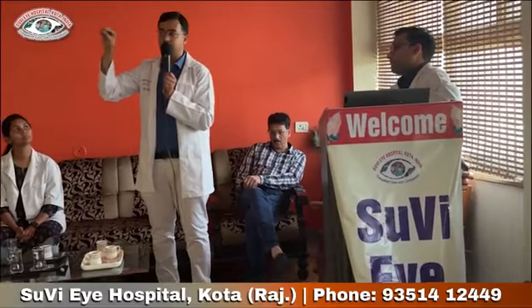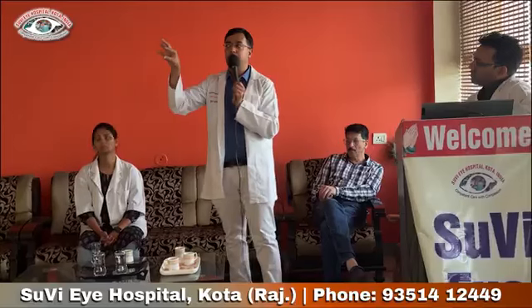With excess barrage, vitreoretinal traction can happen, barrage-induced iatrogenic retinal holes can also happen, and sometimes a lot of PVR changes can happen when the lesion heals. So these barrage-induced side effects can happen.